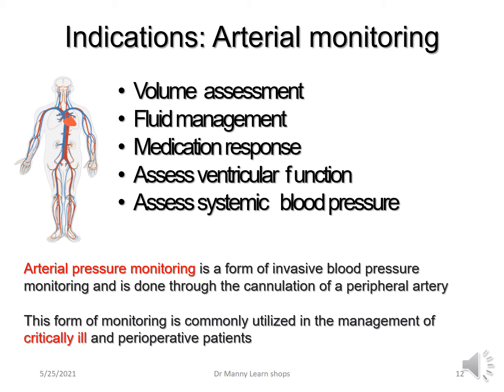So arterial pressure monitoring then is a form of invasive blood pressure monitoring, and it's done through the cannulation of a peripheral artery. And this form of monitoring is commonly utilised in the management of critically ill patients, or intraoperative or perioperative patients, or sometimes postoperative patients.